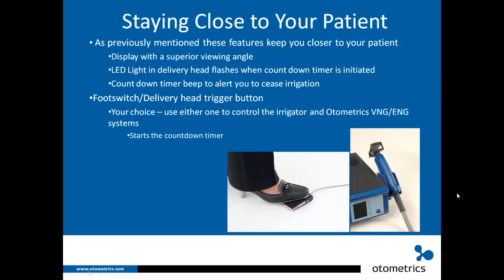Staying close to your patient during caloric irrigation is very important. Several features support this: the display has a superior viewing angle, the LED light in the delivery head flashes when the countdown timer is initiated, and the countdown timer beep alerts you to cease irrigation — so you don't have to watch the main unit. You also have the option of using either a foot switch or the delivery head trigger button to control the irrigator.